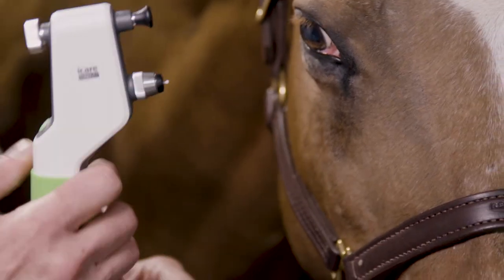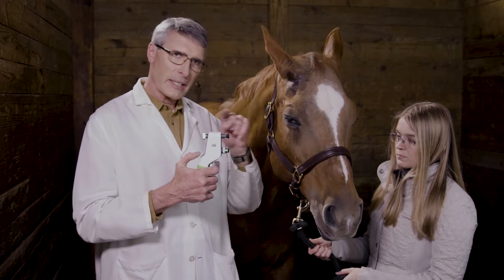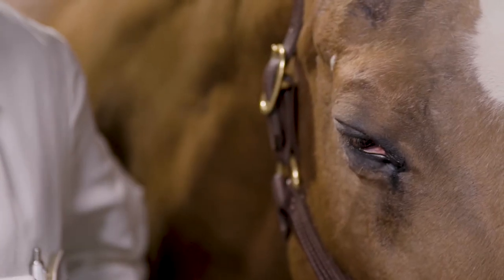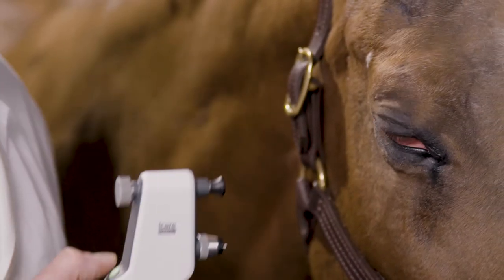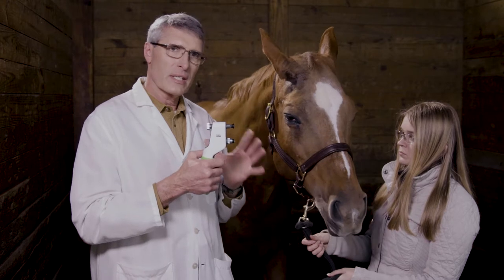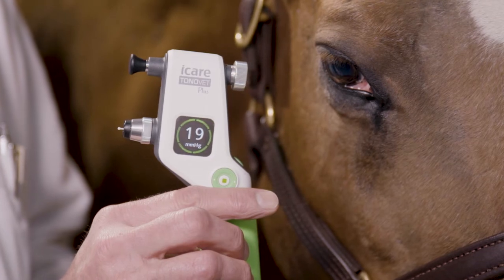In addition to taking individual readings every time I push the activation button, the iCare Tonovett Plus has an additional mode where you can push and hold the button, and it will automatically shoot the pin out six times and take readings. I'm going to gently raise the lid and get in position. Instead of individually pushing the button, the instrument did this for me, which allowed me to hold my hand steady and concentrate on being steady. We see that we got the same pressure — 19 millimeters of mercury — that we had when we did it individually.